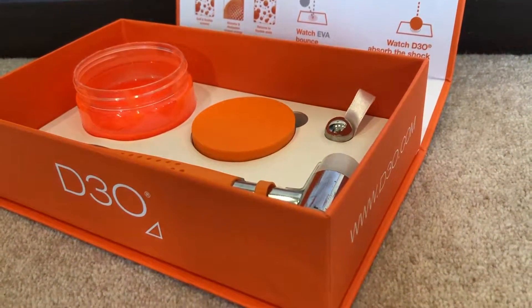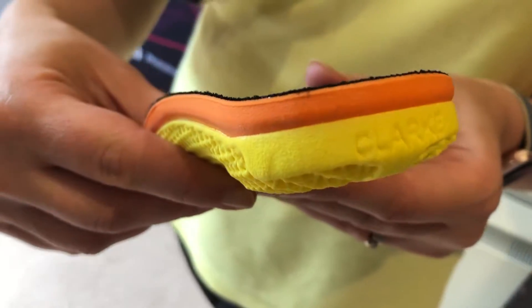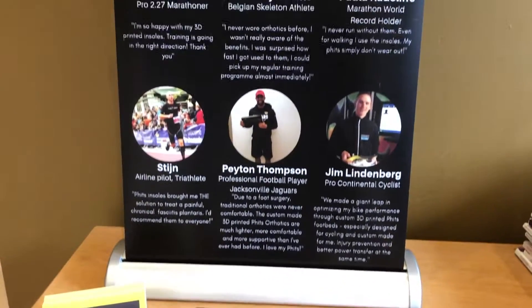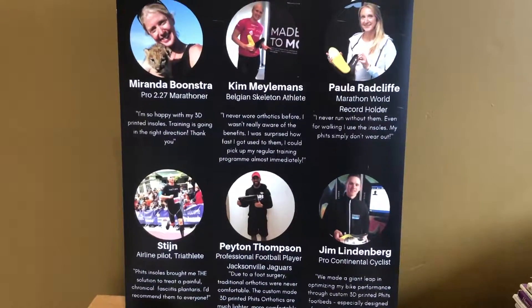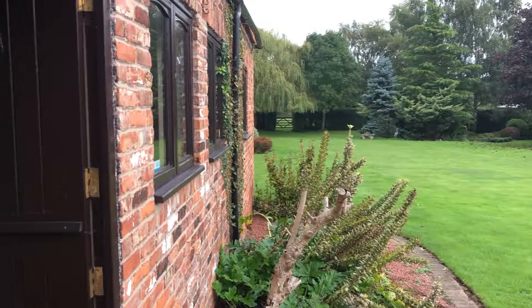We use D3O as a top cover to our insoles, which is the most advanced shock-absorbing material on the market, giving you the very best in impact protection. This is the same material that is now being used in other industries such as the armed forces, professional sporting equipment and motorcycle protection.